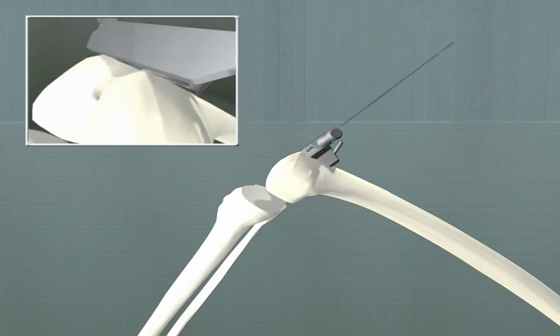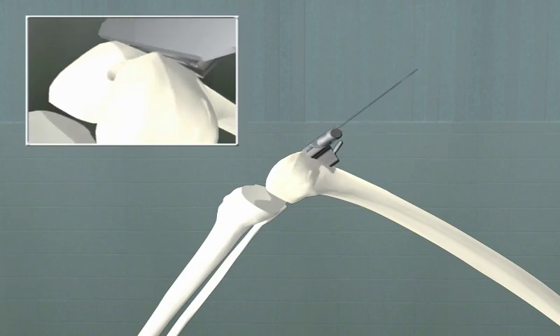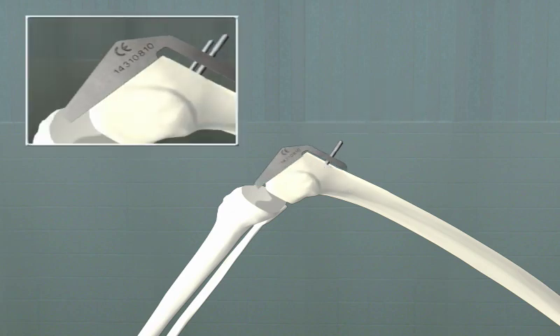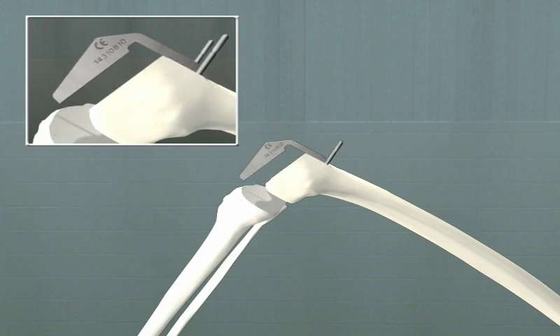The saw capture plate is then placed on the guide, and the distal femoral resection can be made with a power saw. The guide is removed. The distal femoral cutting jig can be used to assess the alignment of that cut.